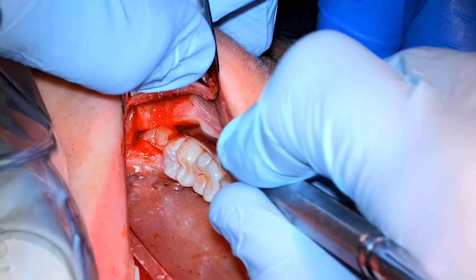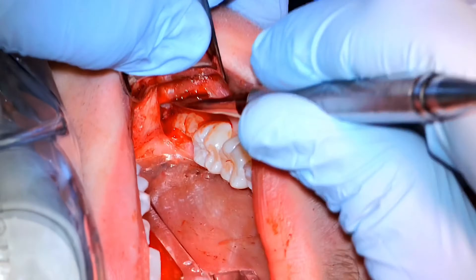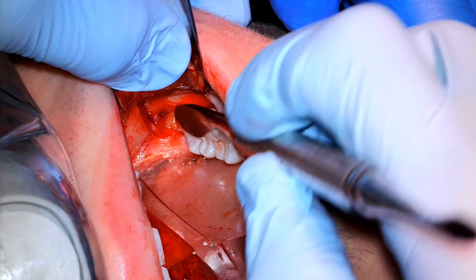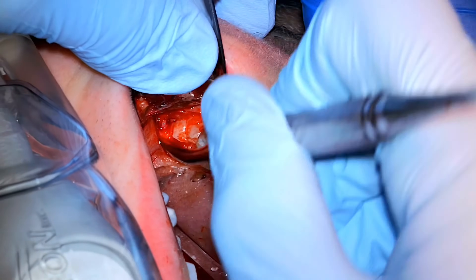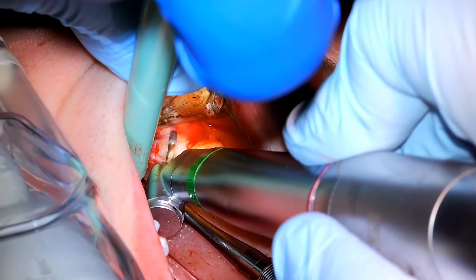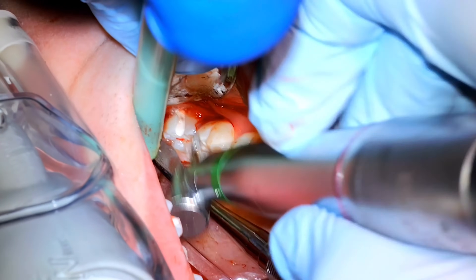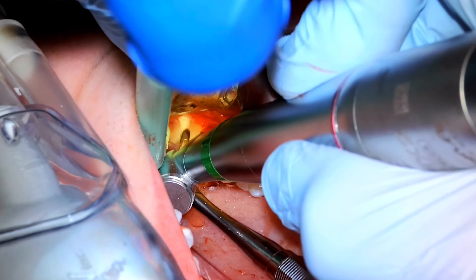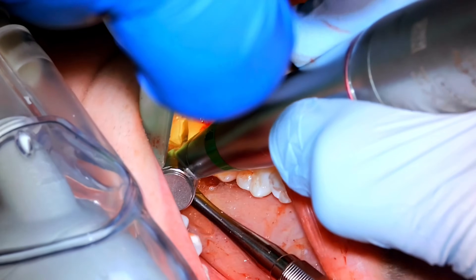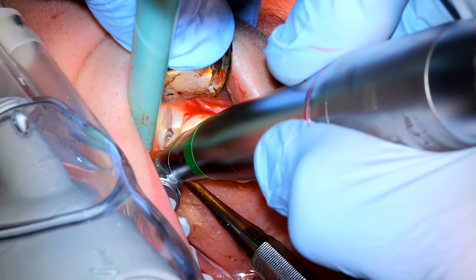You have to get on the bone with that sharp tip of the periosteal — and we found it there. Then we just lever this up using the fat end of the periosteal. Occasionally you get a natural trough — almost like a little ditch in the bone between where the tooth is and where the bone begins — and that's sometimes where your periosteal goes when you're trying to get that flap elevated, which makes it tricky. A tip for that: start a little bit further mesially on the second molar alongside it, then work laterally under the flap to release that more distal portion.